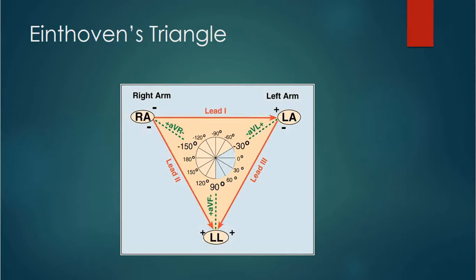Now, there's all kinds of ways to measure axis. There's some 5-minute ECG models on YouTube that can show you how to do it with a 12 lead. There's the up, down, or down, up ratings you see in some of your textbooks, and some of your instructors know. Whichever one of those works for you, by all means, go for it. But if your ECG is able to interpret an axis and give you an actual number, you need to compare that in your head to where the normal numbers are. So you need to remember where the normal numbers are.